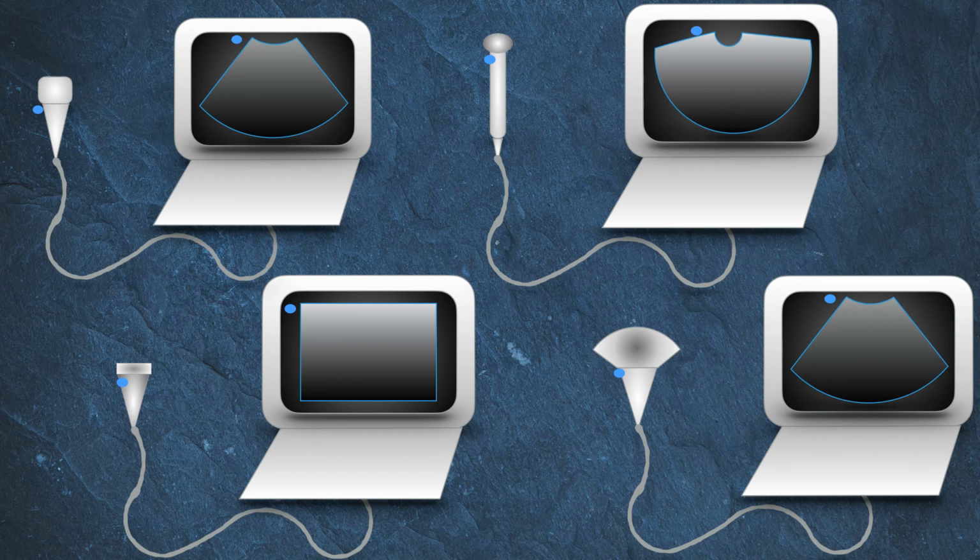The upper right is the endocavitary transducer, which may be used in any cavity, that is oral, vaginal, or rectal. It is a high-frequency transducer which provides significant detail for imaging, and it may be used to identify things like a peritonsillar abscess, obstetric and gynecologic pathology, or prostate pathology. It also has been used to guide procedures.